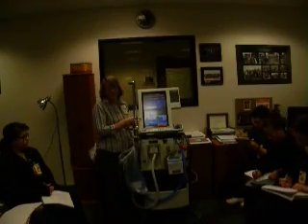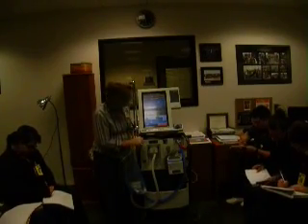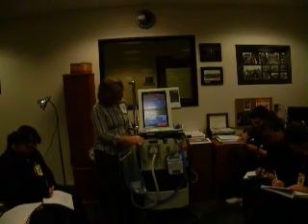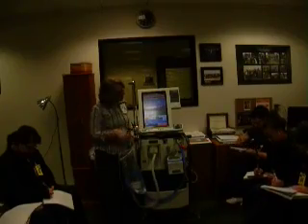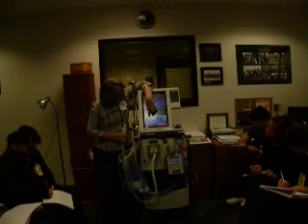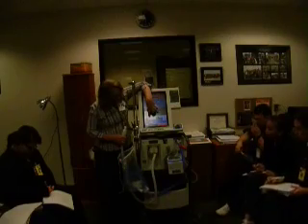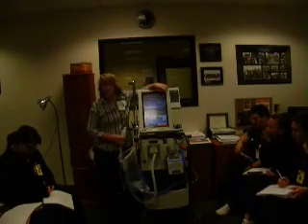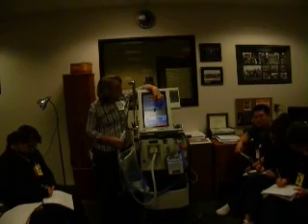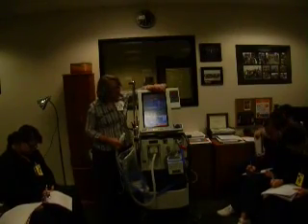And now it gives you the place to actually set your parameters, your rate, your tidal volume. So we've got F for rate, remember, frequency. One of the other nice things about this vent is if you don't know what something is, because every vent, of course, has different abbreviations as well, hit the button, it'll turn orange, and you look down at the bottom. This says VT, and it says VT equals tidal volume. So if you're not sure what something is, push the button and look at the bottom in the orange. Orange is always directions for you guys, so don't forget to look at the bottom.